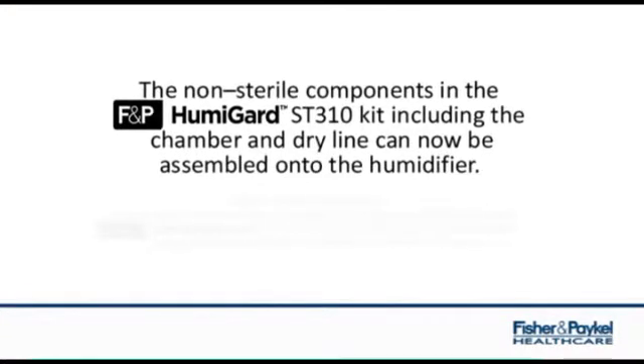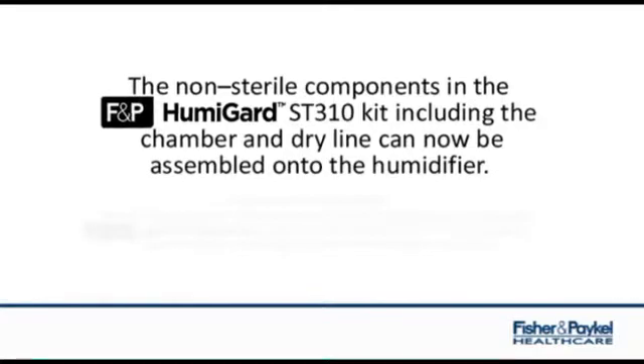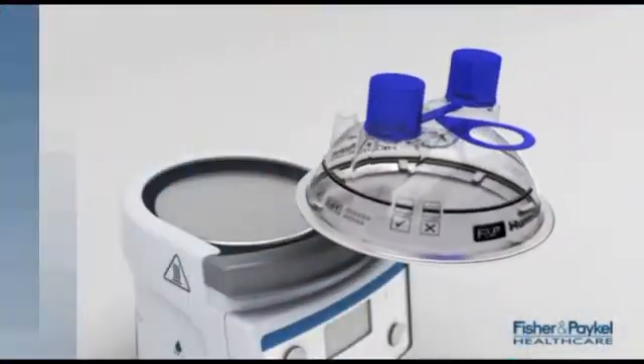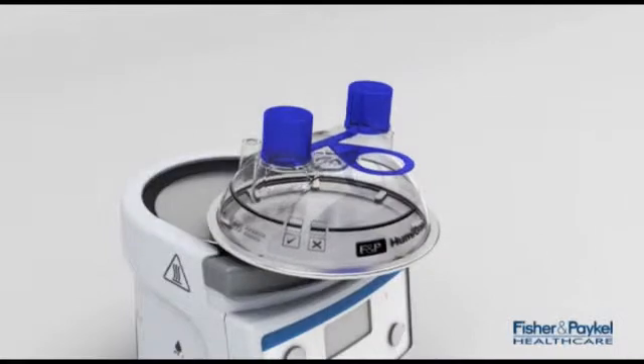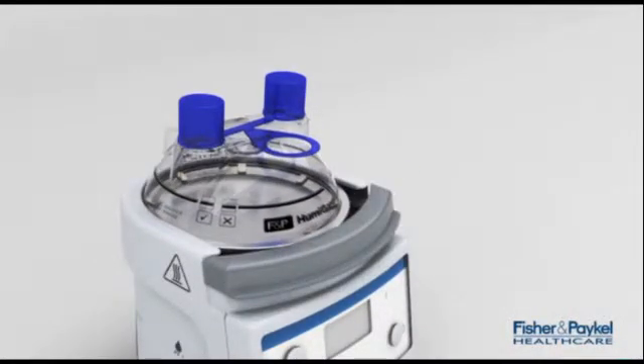The non-sterile components in the Humiguard kit, including the chamber and dry line, can now be assembled onto the humidifier. You'll notice the finger guard and heater plate are spring loaded and can be pushed down ready to insert the chamber.